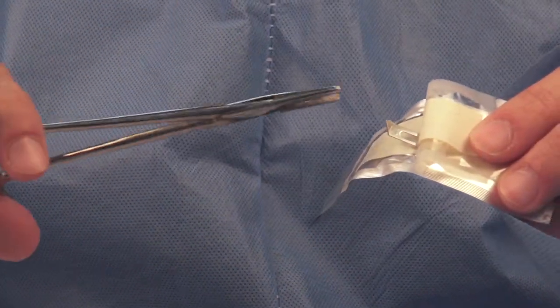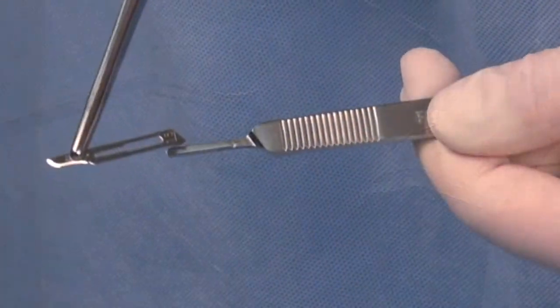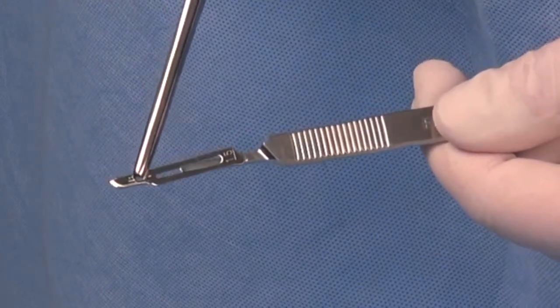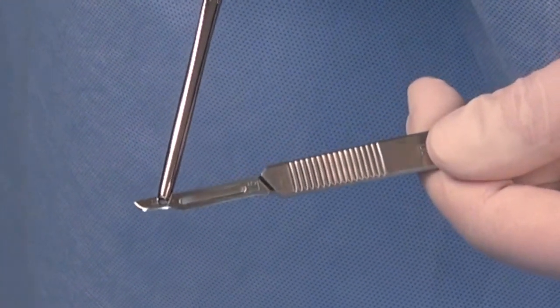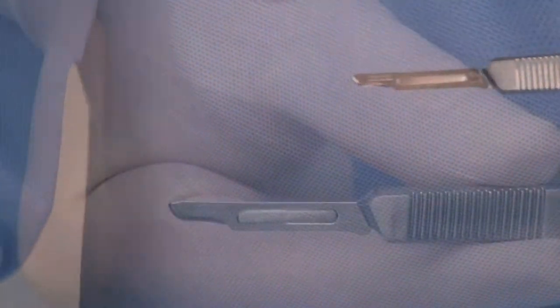To preserve the sharpness of the blade, grasp the blade with forceps or a needle holder at a 45 to 90 degree angle. Holding onto the spine of the blade just above the blade slot, insert the handle into the blade track and slide the blade back onto the handle until it snaps into position.